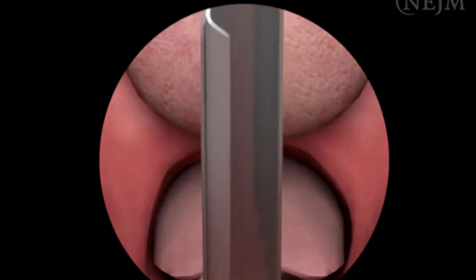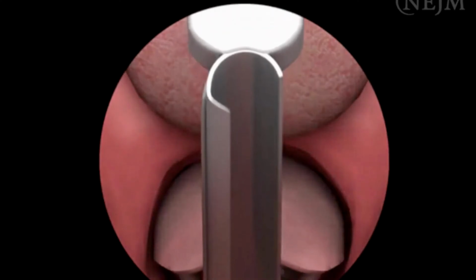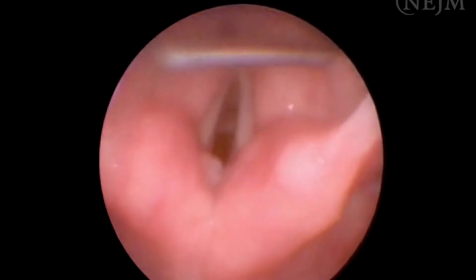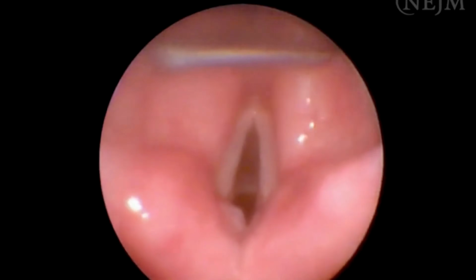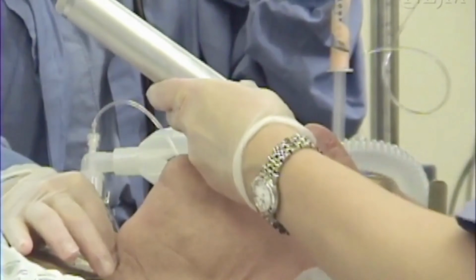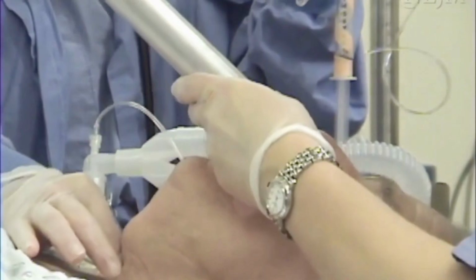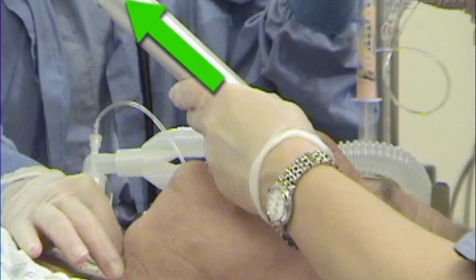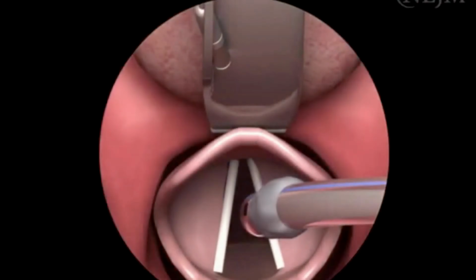Continue advancing until you identify the epiglottis. This is your key landmark. If you don't find the epiglottis, everything else becomes guesswork. Once the epiglottis is identified, lift the laryngoscope upward and forward. Do not rock back on the teeth. You are lifting the mandible, not prying open the mouth. As you lift, the vocal cords should come into view.